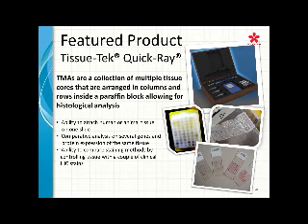And just one more question is, how critical is it to use DI water versus tap water? It's really critical. I went through a phase where I wasn't too sure. I kind of did a study on my own, because it was like, if you put tap water in your water bath, how will that directly affect immunohistochemistry staining? But each city and location that you're in, the tap water has a different type of pH.